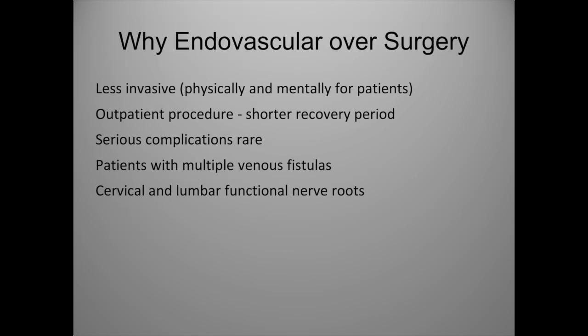So why choose endovascular over surgery? Well, it's less invasive. It's physically and mentally, psychologically much more acceptable to most patients, although there are some patients who like the concept of having surgery and being done. Serious complications are rare. It's a really safe procedure. You're on the venous system, not on the arterial system, and unless you go through a major vein and cause major hemorrhage, it's a safe procedure.